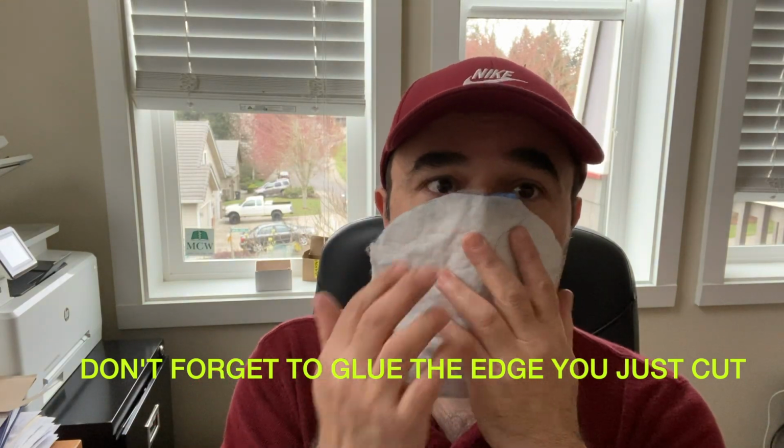Again, you'll make sure that it's cut along the cheekbone, and again, it should be laying in front of your face. Pinch the top, and then put your clip again. Put that small clip. Okay. So now you have this.